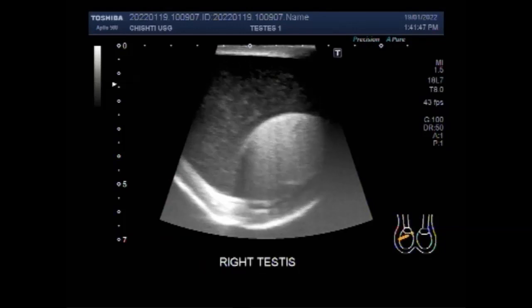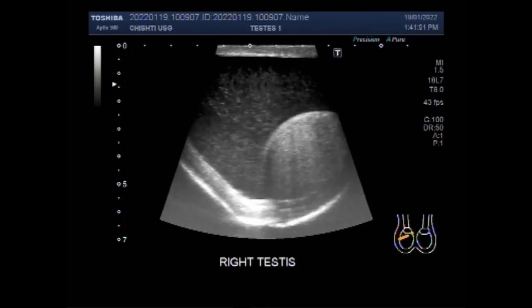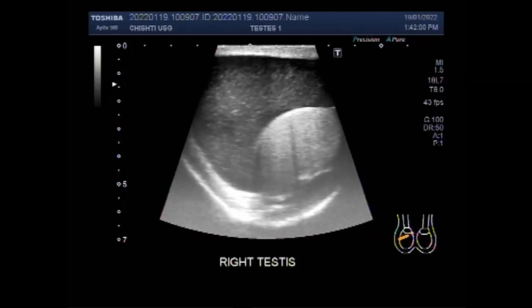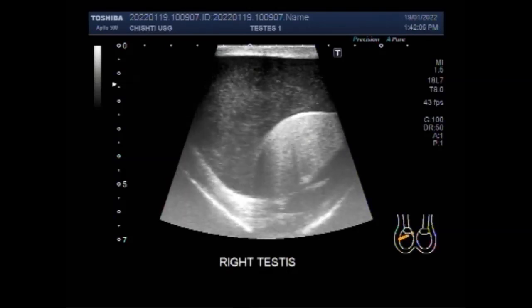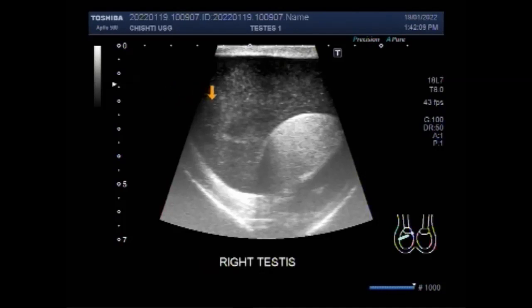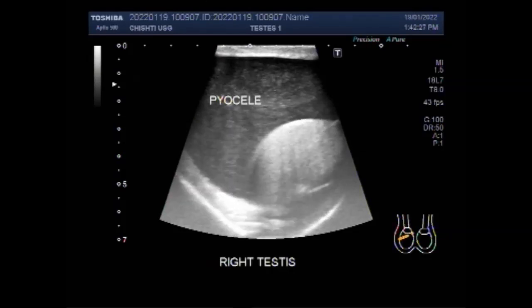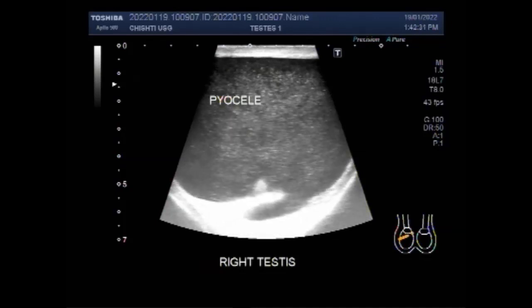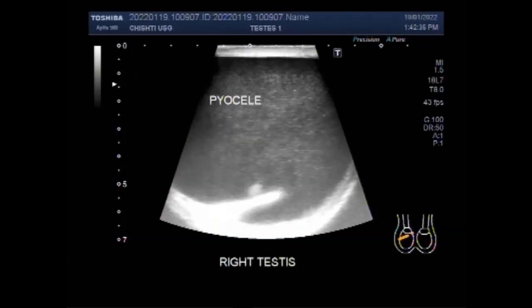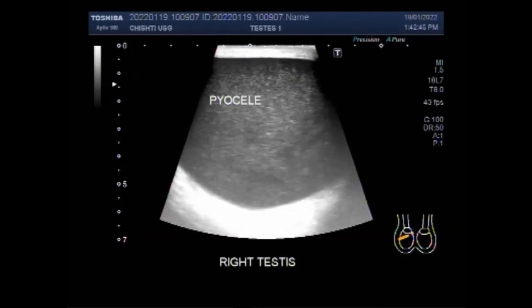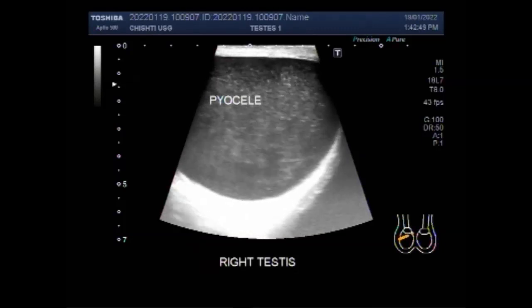At sonography, congenital hydrocele appears as anechoic fluid collection surrounding the anterior-lateral aspect of the testis, sometimes extending to the inguinal canal, or as fluid collection with low-level swirling echoes related to protein aggregation or deposition of cholesterol crystals. However, this is an adult patient aged about 40 years, so pyocele or blood should be suspected. A pyocele can develop as a result of injury or inflammation within the scrotum, such as infection in the testicle or epididymitis.